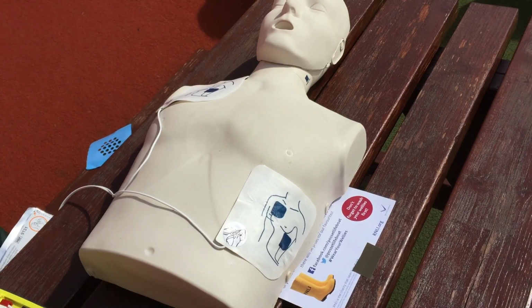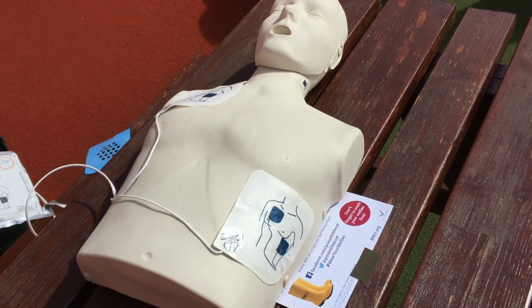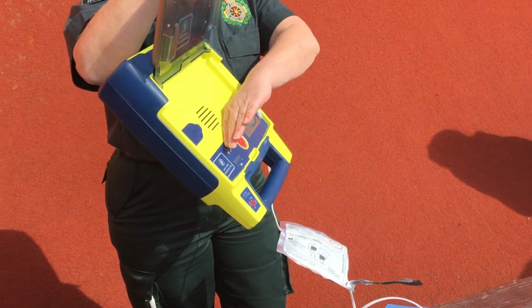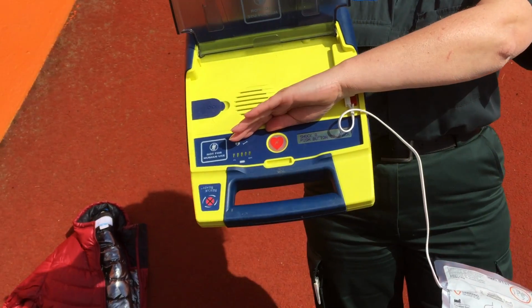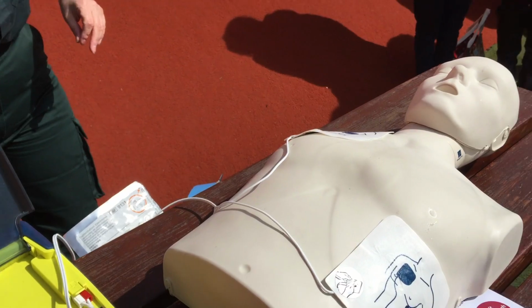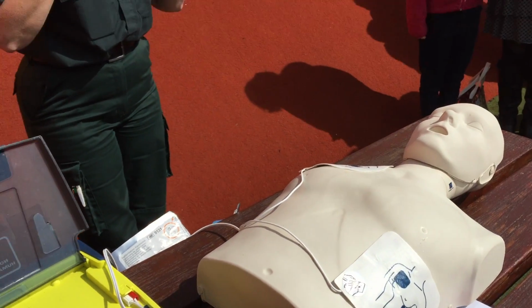Shock advised. Charging. Stand clear. Push flashing button to deliver shock. Probably can't see very well in this sun, but that is a red light flashing. It's telling you this person needs a shock. So really important, you need to make sure everyone's clear.